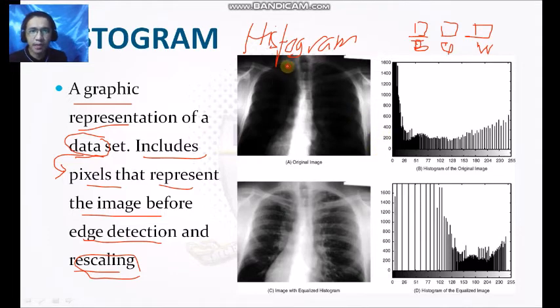For example, as mentioned earlier, lungs appear black because they are a very low density structure. The lungs contain air, so more X-rays will be allowed to pass through, and it would appear as black.